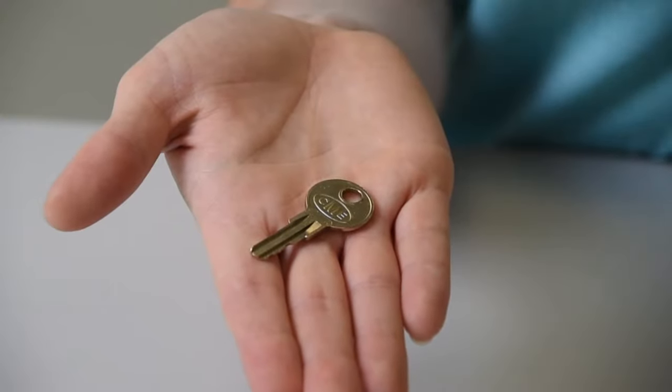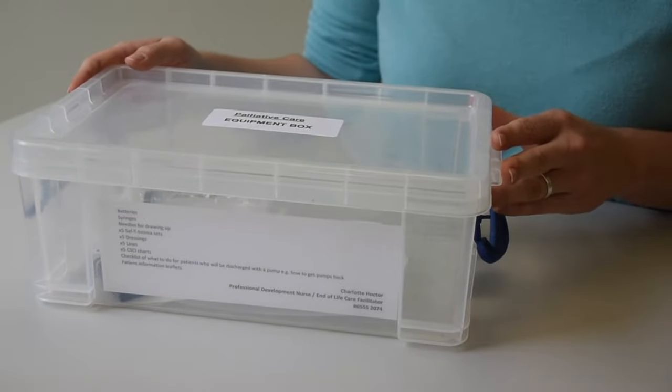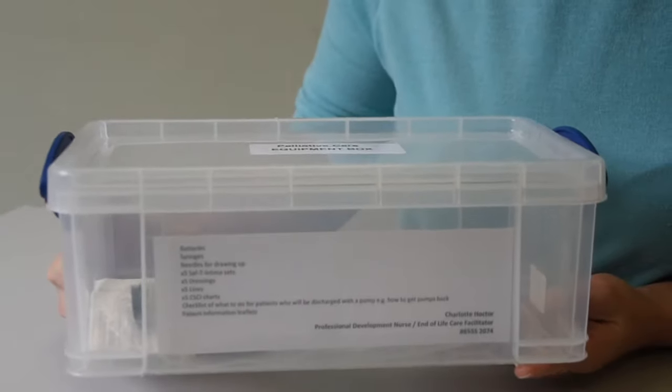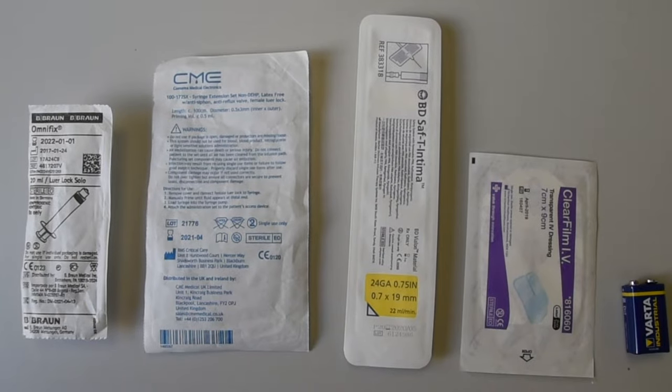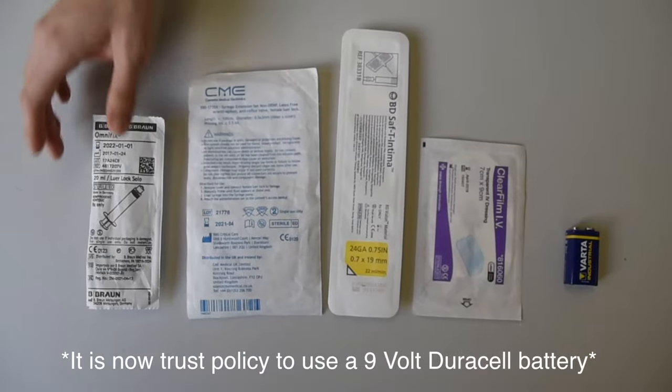What equipment do I need? Each ward should have their own key for the locked box on their CD keys. Each ward will receive an equipment box that will be delivered with the pump. It should contain a supply of 20ml Luer lock Braun Omnifix syringes, needles for drawing up with, CME giving sets, Safety Intima, clear dressings, batteries, and prescription charts.